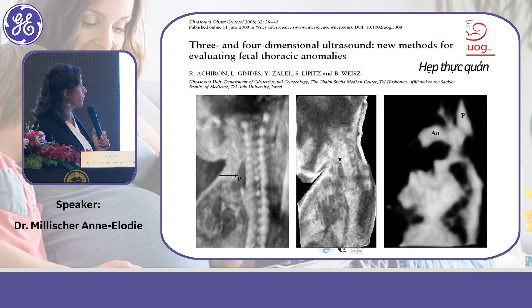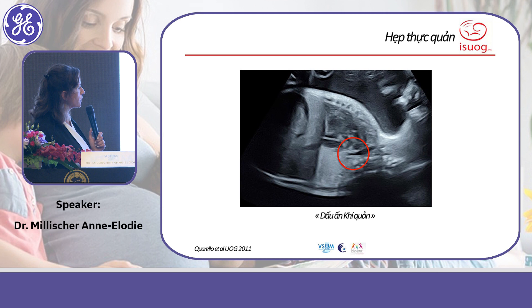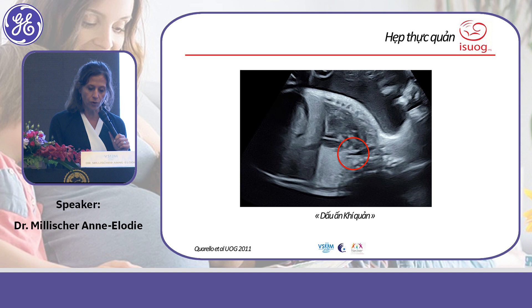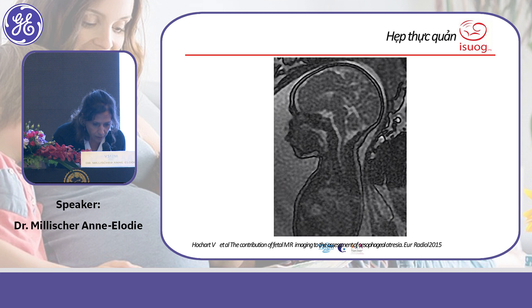Here is another example of dilatation of the esophagus. As you can see, the level of the vertebra involved is often the second or third thoracic vertebra. You can then confirm this with MRI.